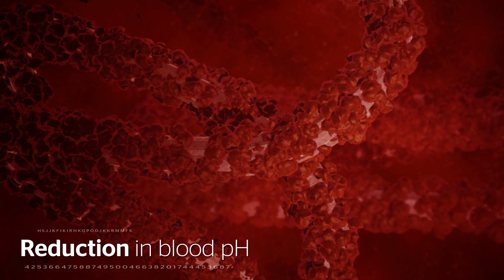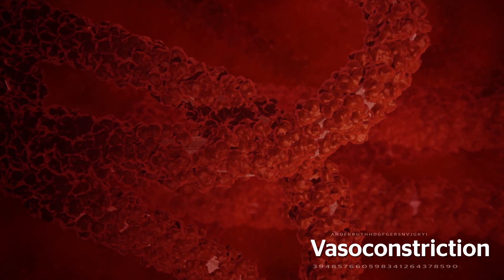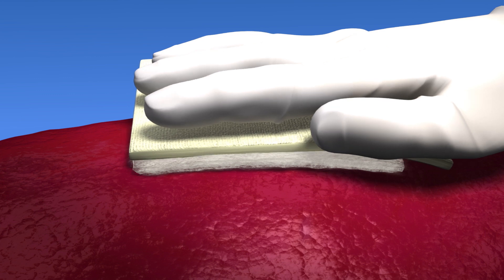While at the same time, the interaction of ORC with blood leads to a localized reduction in blood pH, causing vasoconstriction and reducing the rate of blood flow to the area, enhancing platelet activation and adhesion, enabling safe, rapid hemostasis.